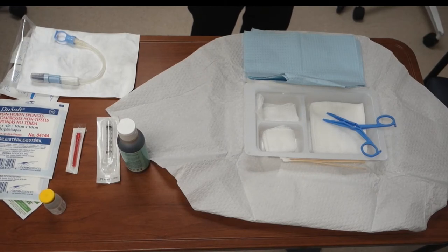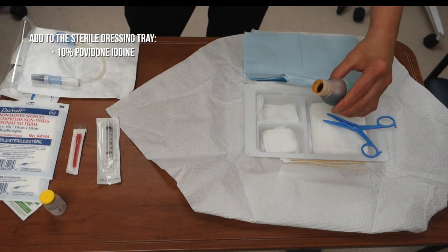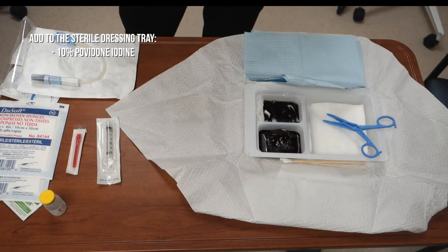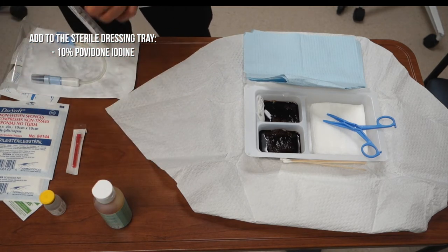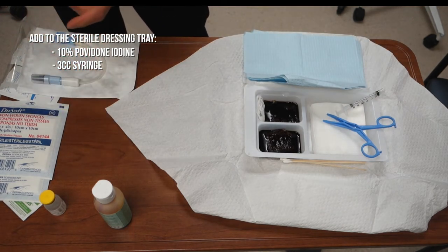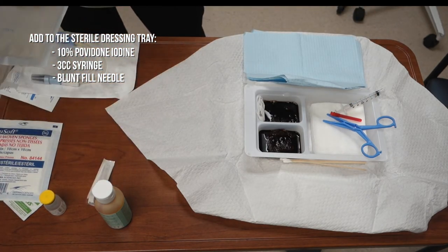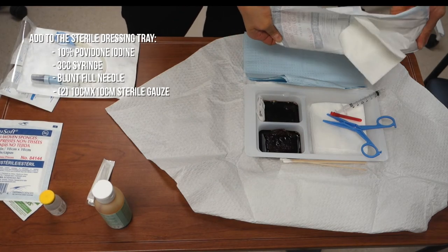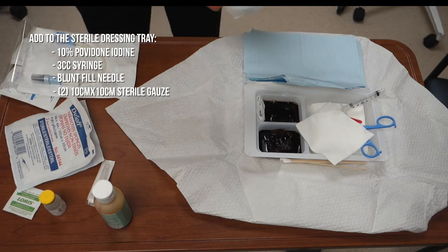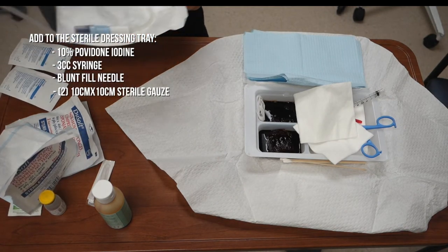First you will open your tray, then you will add povidone iodine, a 3cc syringe, a blunt fill needle, 2 sterile gauze, and a Baxter transfer set.